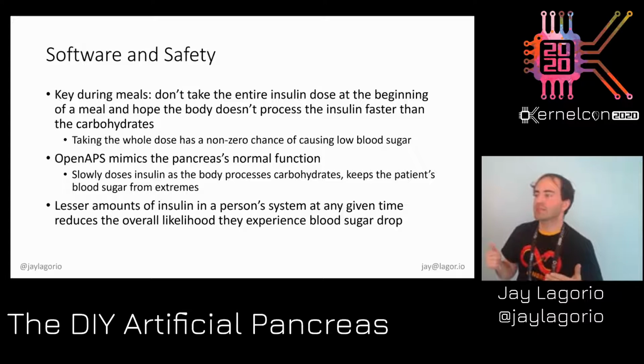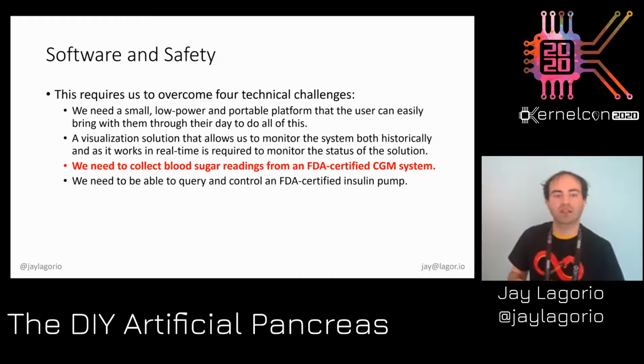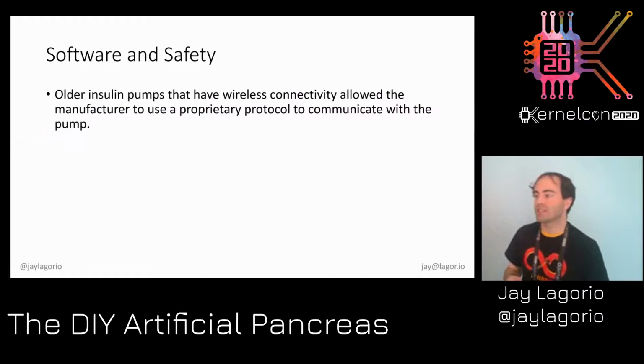So speaking of safety, let's look at some safety aspects that were discussed in the media last year where poor choices cost people some reputations. I mentioned that we were required to overcome 4 technical challenges. One of the most important is that blood sugar readings should be from an FDA-certified source. This is rule number 1 of Fight Club, and all of us at a HackerCon can understand garbage in, garbage out, right? So when someone tries to interpret raw sensor data their own way and has their devices act on it for them based on that flawed data, and then lands themselves in the hospital because of it, it's pretty frustrating to the rest of us because now regulators and manufacturers are practically required to go out and add fear, uncertainty, and doubt to the discussion.